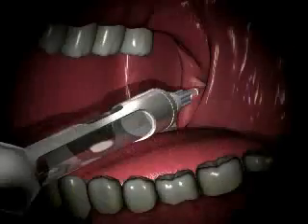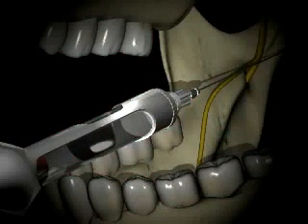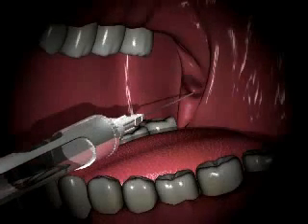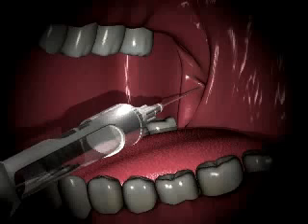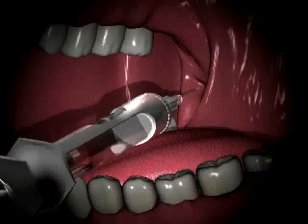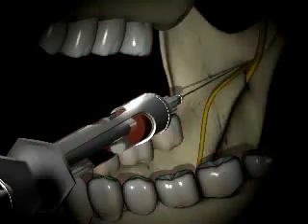If you do not contact bone after 25 millimeters and the needle is almost buried, you should redirect by withdrawing somewhat, but not completely, and move the barrel of the syringe more laterally, advancing again until bone is contacted. You should repeat this procedure as necessary.